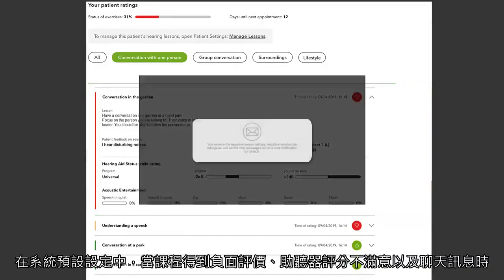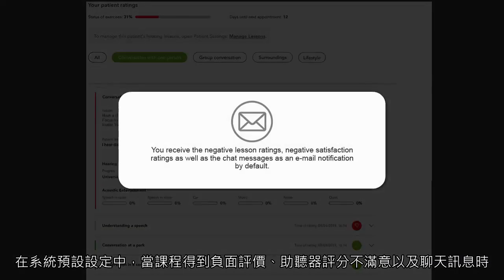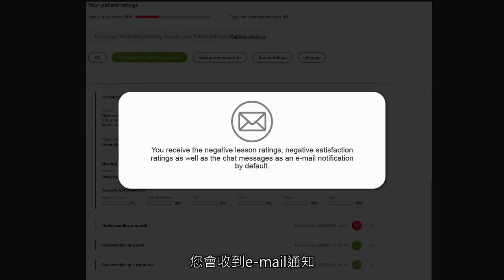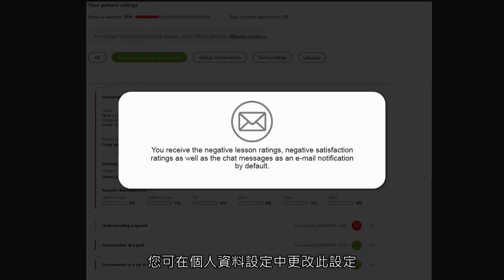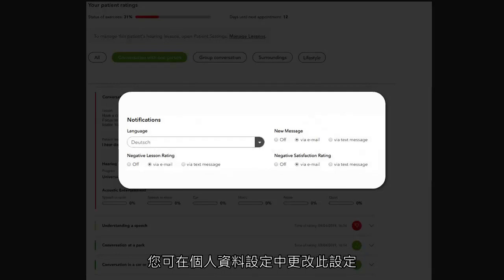You receive the negative lesson ratings, negative satisfaction ratings, as well as the chat messages as an email notification by default. You have the possibility to change this configuration in your profile settings.